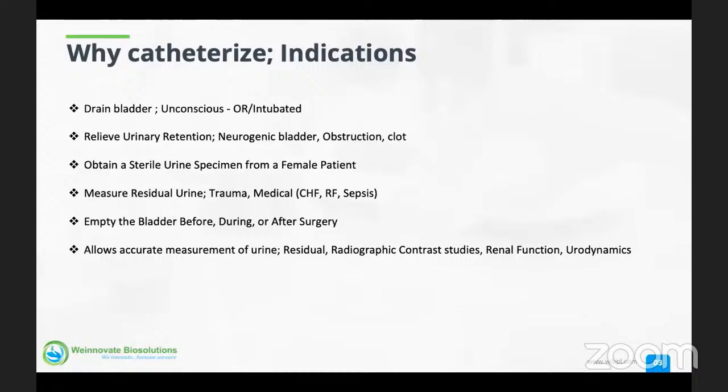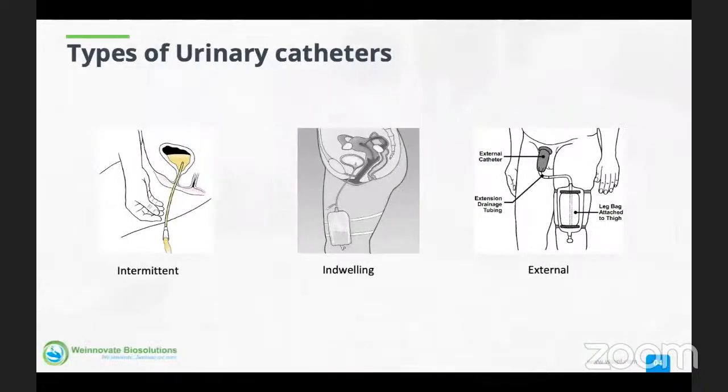It is also an important parameter to find out residual urine, for radiographic contrast studies, for renal functions or urodynamics.